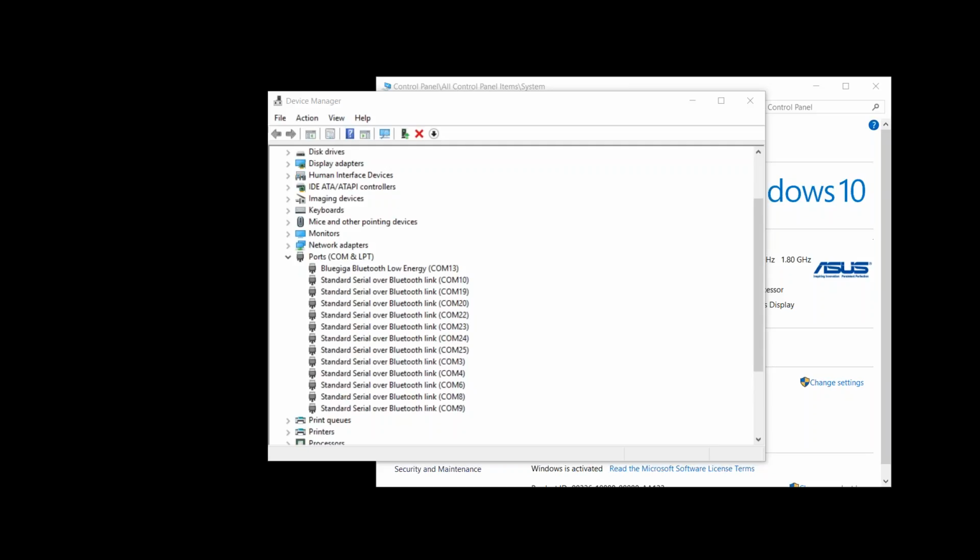Yeah, another question about the protocols for the MFT tests. We have instructions actually coming for that. I can't remember the exact specifics, but we have the general MFT tests, and then we have more specific tests for cycling and running, and the specific instructions are coming.